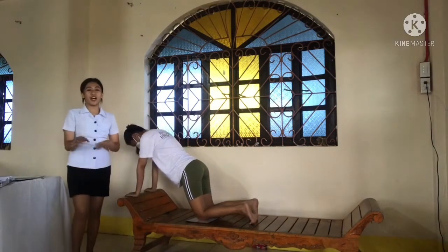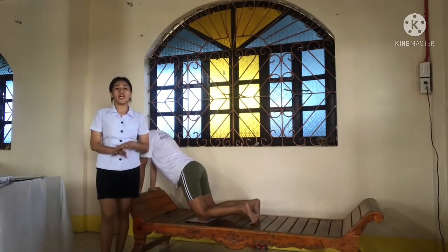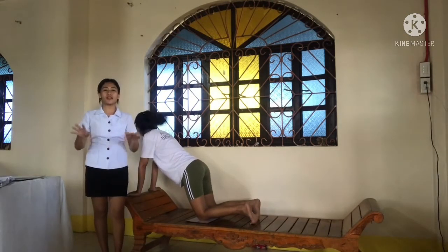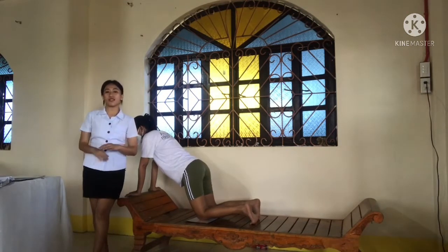So place the IR against the anterior surface of the patient's knee and center the IR to the apex of the patella. Flex the knee 70 degrees from full extension, which is the 20-degree difference from the central ray.